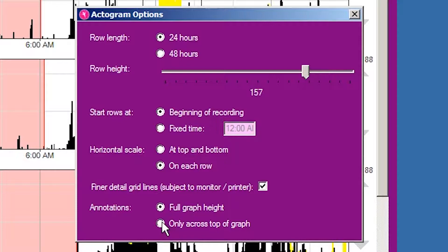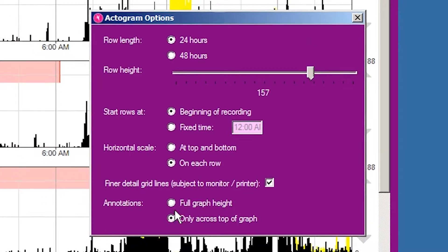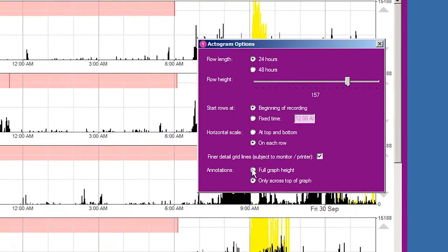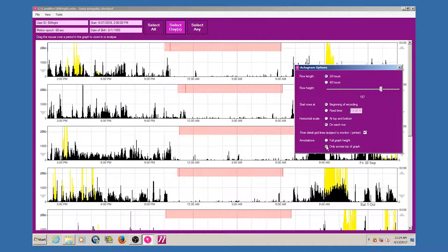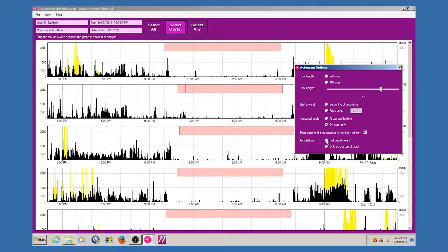Finally, the annotations allow marker lines and highlighted periods adjustments on the graph. Choose if they are to be shown at full graph height or just at the top of the graph. This can help to make the graph clearer when there are many marker events in selected periods.